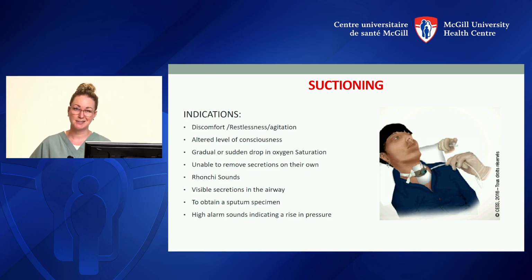Also, if the patient states they need to be suctioned, it's probably a good indication. You could always encourage them to try and cough it out themselves, but if they still can't clear it, then we will need to go in and suction the patient.